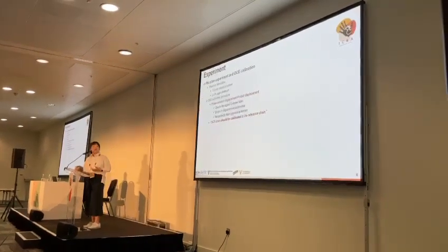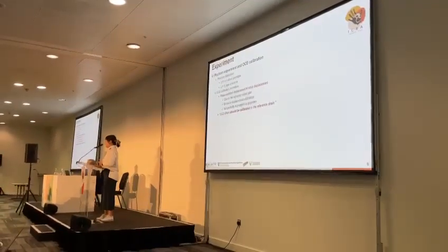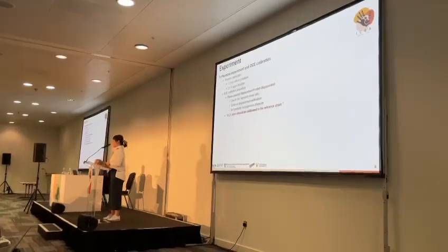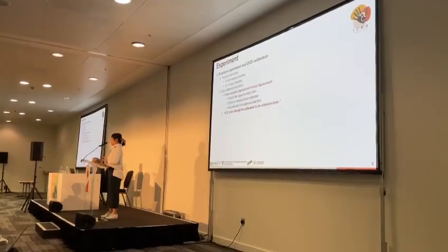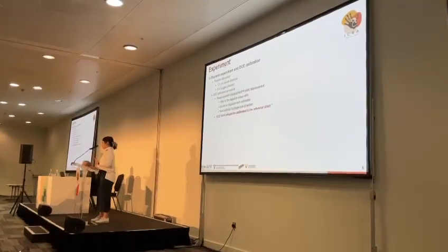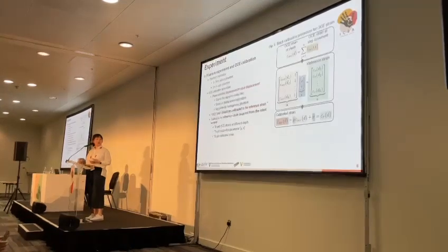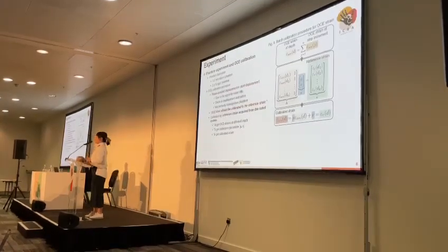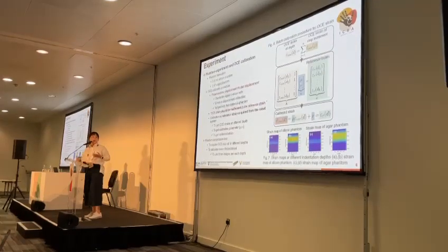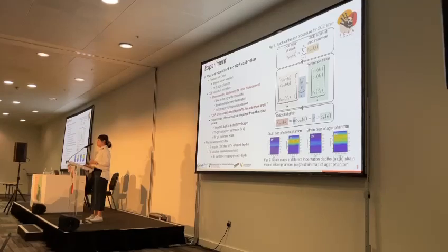OCE strain is different from the robot strain due to the signal-to-noise ratio limit of the OCT system and errors in the vector-based displacement estimation method. Also, the phantoms are not perfectly homogeneous, isotropic, or linearly elastic. The OCE strain should be calibrated to the robot strain. The calibration procedure is depicted in figure 6. We acquired OCE data at 14 different depths and use the mean displacement between each step.